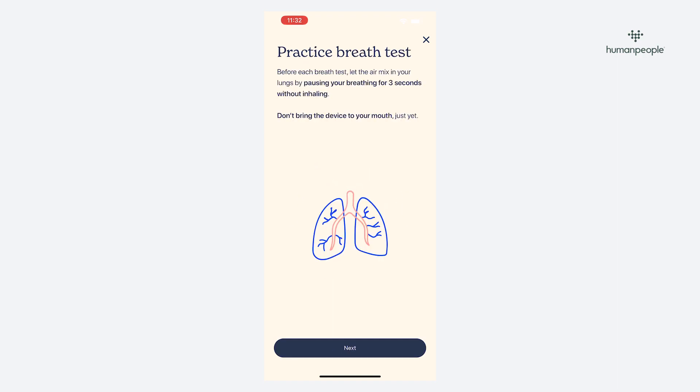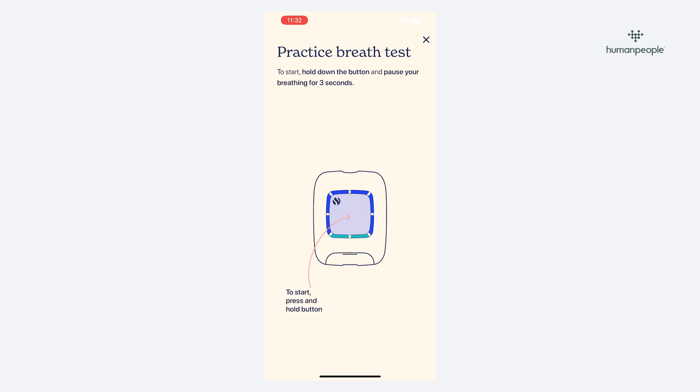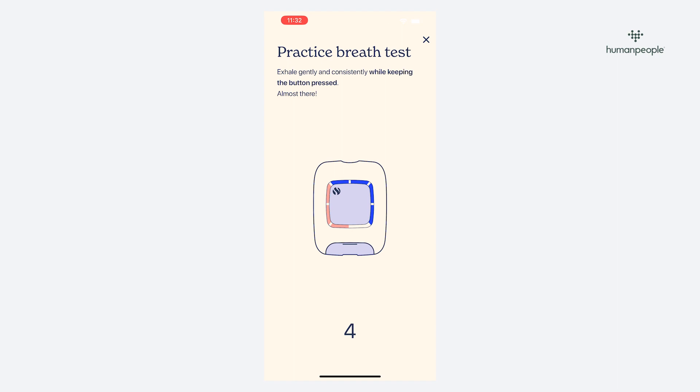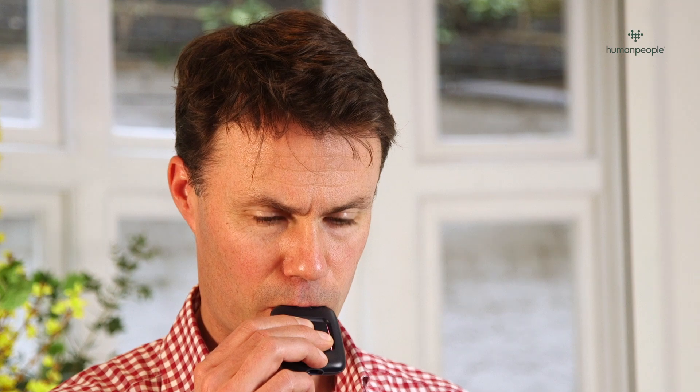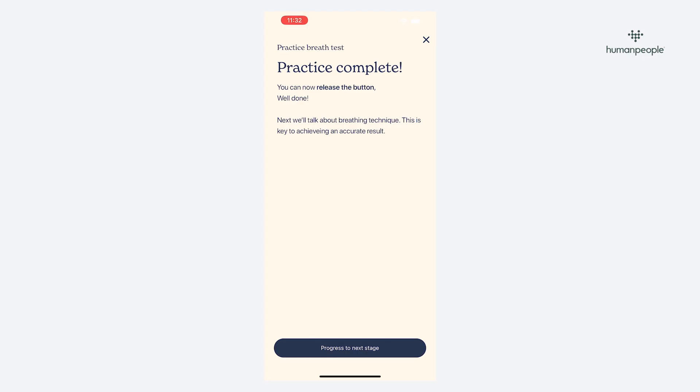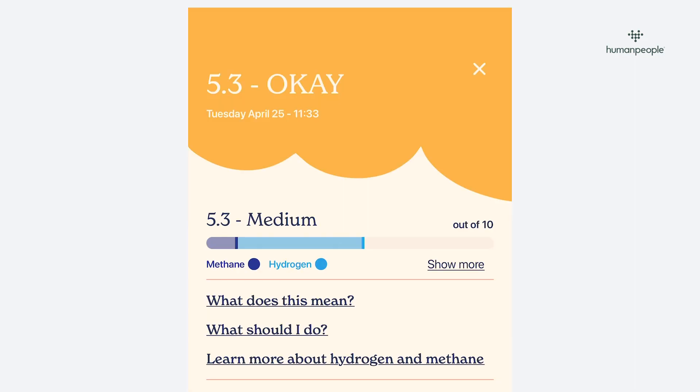You will then be prompted to provide a test breath sample. You can follow along with the training section to help you get the hang of it. Hold down the large button on top of the device throughout the test. You will need to stop your breath for three seconds without inhaling, then gently blow into the shiny section of the device for five seconds — this is a slow, steady breath, as if you're trying to cool down soup.